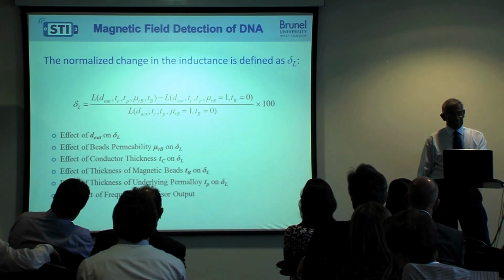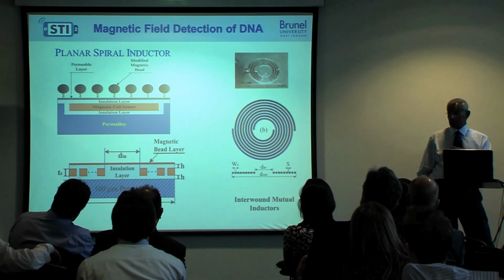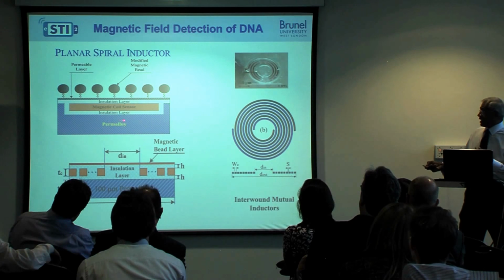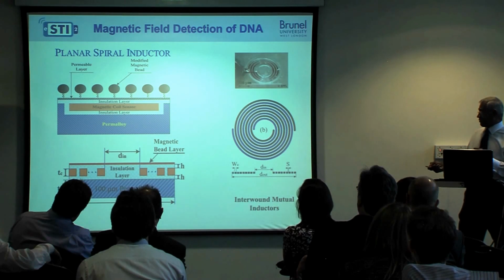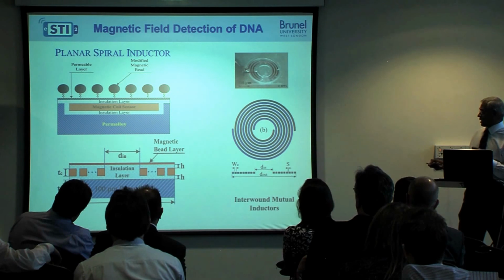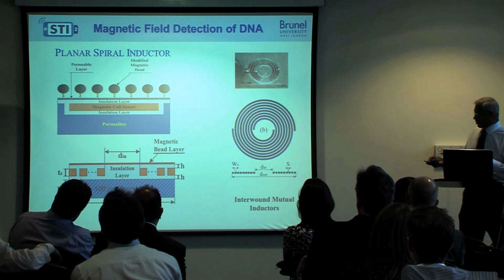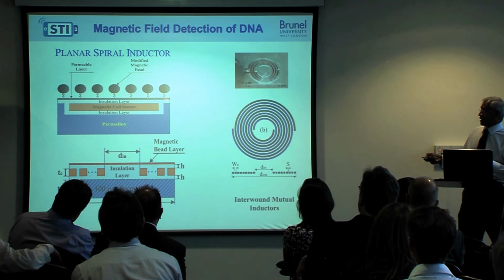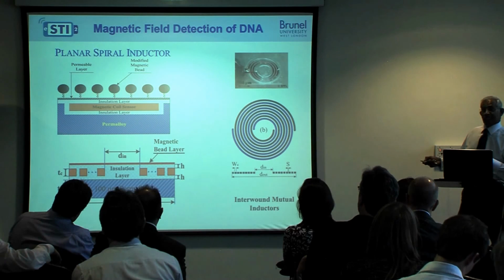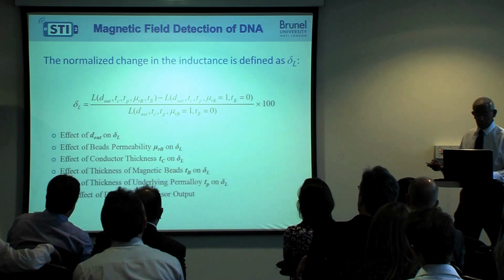We are also working on DNA detection technology using magnetic fields. The basic concept is that if you have a permalloy substrate, then you have tiny magnetic coils. And again, we've done some modeling work, and we've come up with structures like this, interwound coils. You have a primary and a secondary coil. You apply, almost like a known transformer concept. And if you immobilize the probe DNA on a functionalized substrate in here, and then you bring the target DNA attached to magnetic beads, when they hybridize, you see a change in the induced field, which is proportional to the amount.